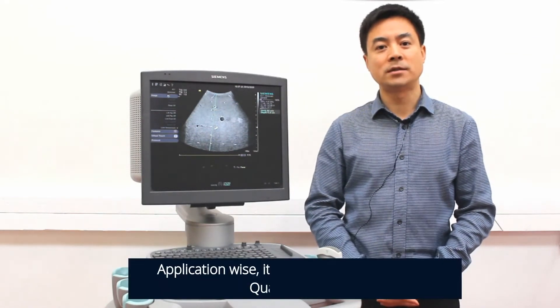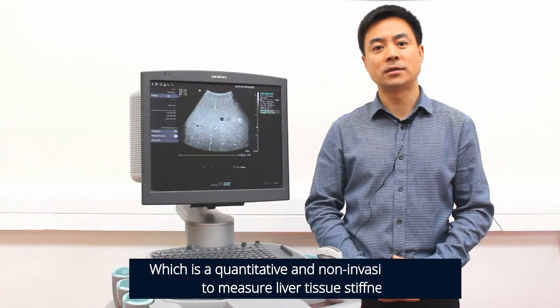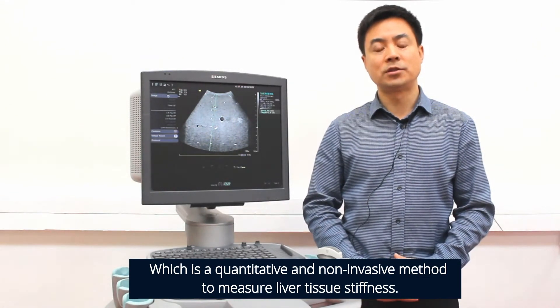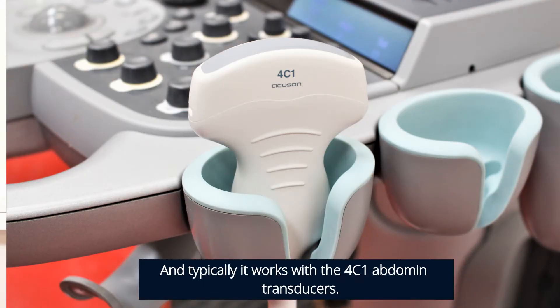Application-wise, it is called Virtual Touch Quantification, which is a quantitative and non-invasive method to measure liver tissue stiffness. The technology is available on the S2000 and S3000 ultrasound, and typically it works with the 4C1 Abdominal Transducers.